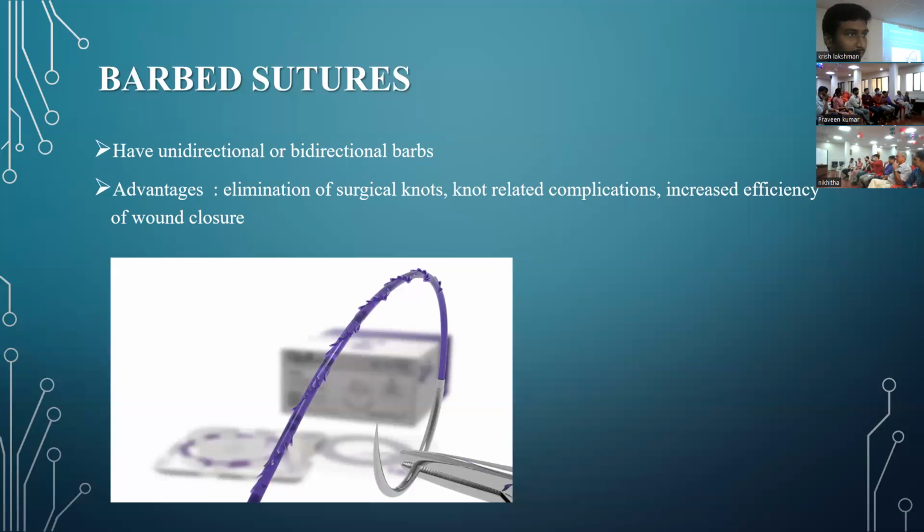The advantage is that in laparoscopic surgery, when you have difficulty in suturing, or you're not extremely proficient in suturing, or you're worried that your suture might get loose, that is when you're going to use a barbed suture. Now, there are two or three ways of preparing barbs in the suture. One is you integrate the barb onto it. Or second, you cut the suture slightly like how it looks in the image, making small slits here and there. Which is better? Integrated. Correct. Why? Because cutting weakens the suture. So always integration into the core is much better than making small slits during production of the suture.